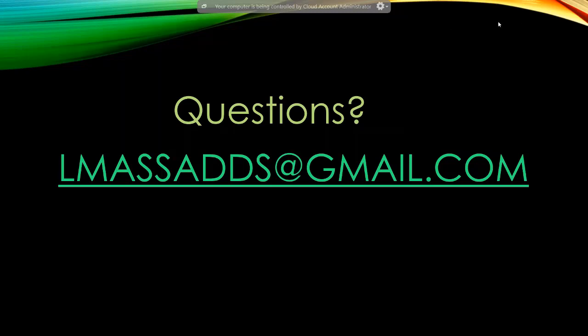With my consideration of lab background, I really see that that's the way a lot of things will move as time goes on, that laboratories will be more involved in designing and offices can actually put out the product. That saves a lot of time delivering products back and forth. So certainly it is possible. Again, it's about having the relationship with the laboratory to allow that to happen.